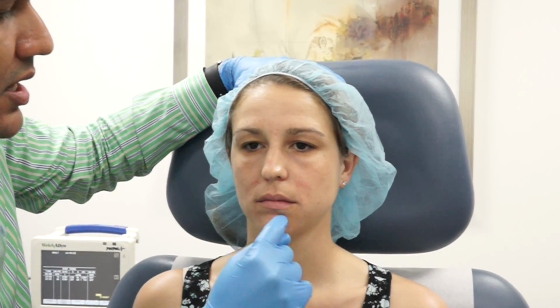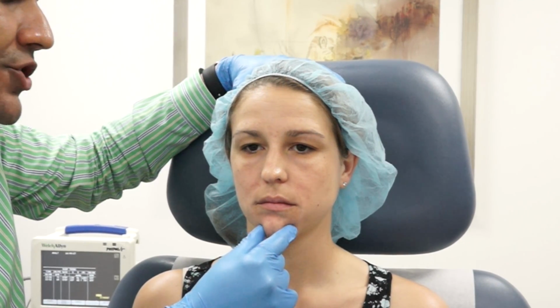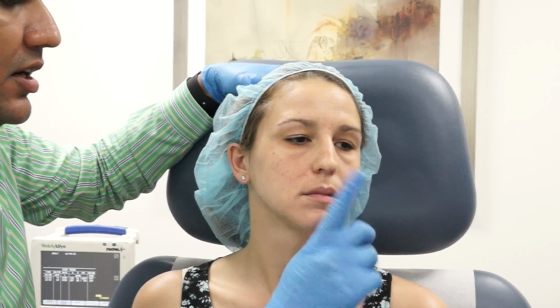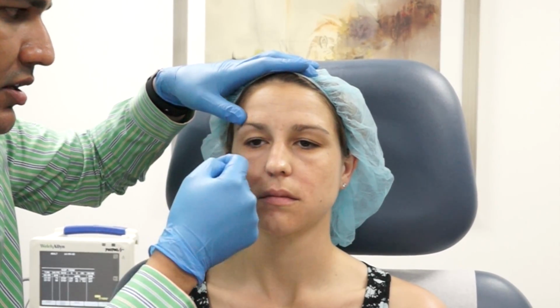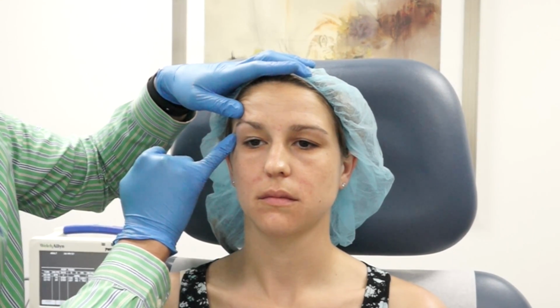Other things that we've considered in Carly is she has a prominent mental sulcus, and we will probably be augmenting her chin a little bit with some filler, just to sharpen, give her a little bit more proportion, and fill in some support anteriorly. Last thing on Carly, I'm just going to finish up at the end with the Botox. She has some brow ptosis, and so there are a couple of ways to address the descent of the brow. One of the ways is injecting Botox and lifting up the brow, but the other way to do that is to add some filler along the brow as well. And both of those may be options in Carly's case.